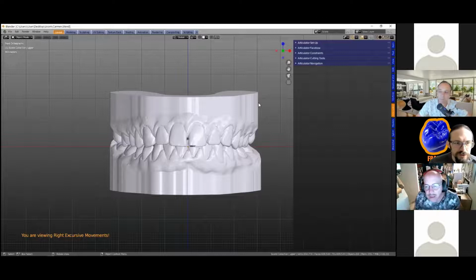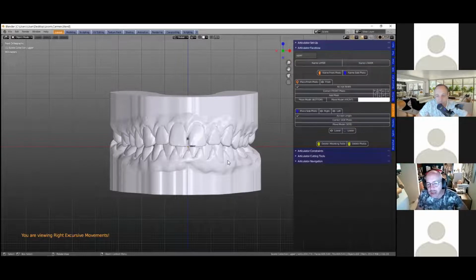All right, so let us go into the Facebow now, and this has changed a little bit. So here we've got my niece's mouth, Wolfgang's daughter. Thank you to Carmen, she's a supermodel now, superstar. She's a triathlete, super triathlete.